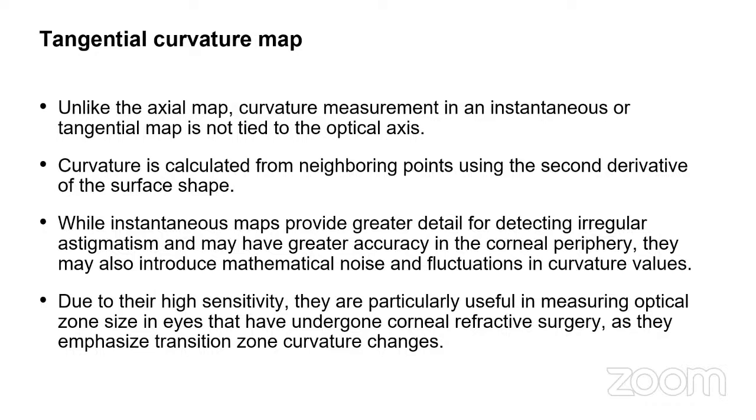Due to their high sensitivity, they are particularly useful in measuring optical zone size in eyes that have undergone corneal refractive surgery, as they emphasize the transition zone curvature changes.